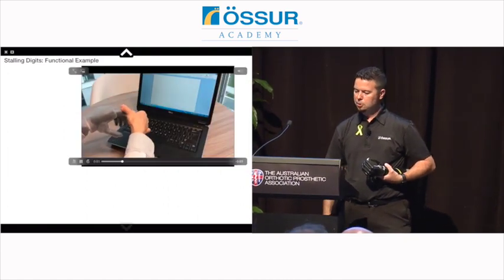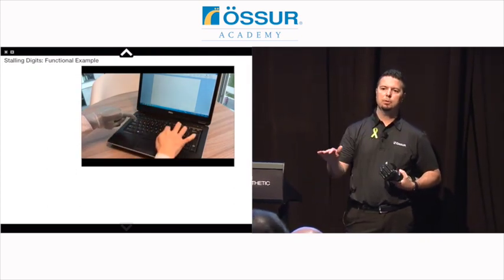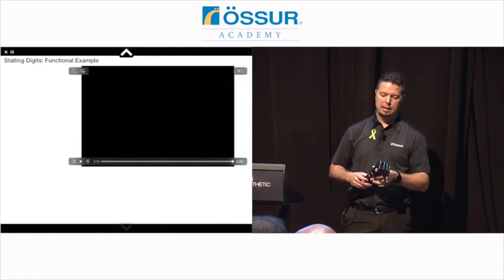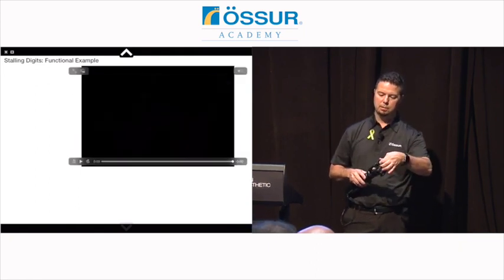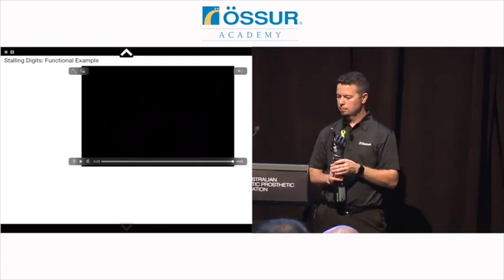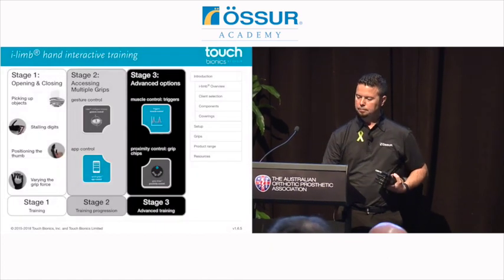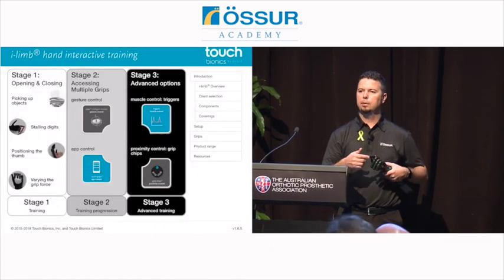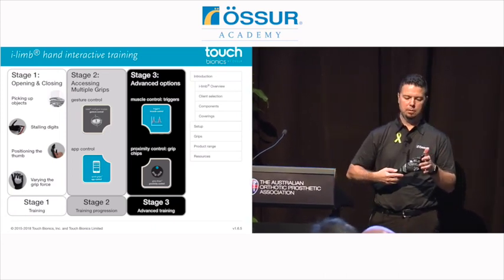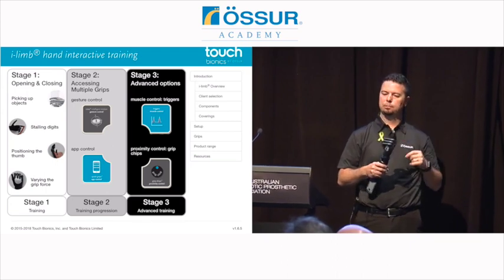And why that might be functional is you can put the hand in all sorts of functional positions without using any setups or grips. In this example, she just stalls the index finger and has the hand in a position that she can type on a keyboard, no programming, again, she's just stalling a digit. Does that make sense? Another way people put it is they call it blocking a finger. I kind of like that too. You're blocking the motion, so you're just blocking it as you provide a close signal.